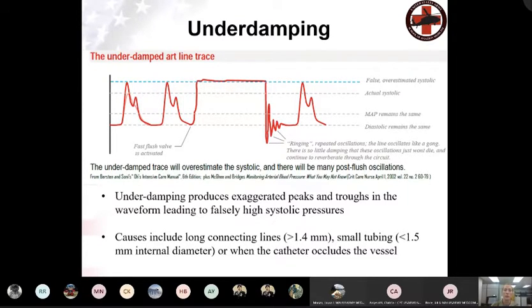Now, this is going to bring me to make a point about trying to say that non-invasive blood pressure and invasive blood pressure readings are substitutes for each other. They are not. Okay, the science there on getting a non-invasive pressure versus an invasive pressure is completely different. You can't necessarily substitute one for the other. However, it is a good idea when you first start out and you're doing your assessment to compare your non-invasive blood pressure to that invasive line, just so you can kind of get an idea. Just be cautious with using those numbers interchangeably.